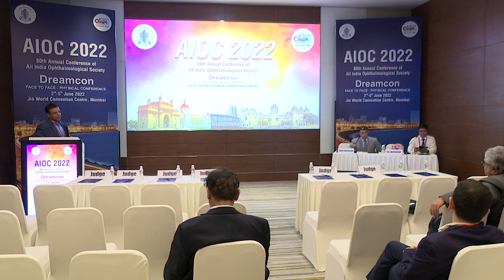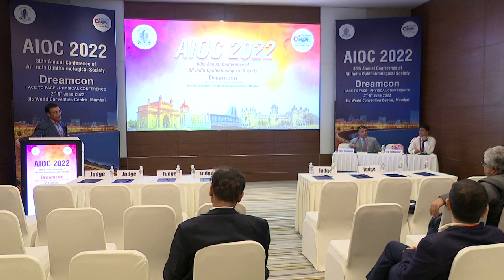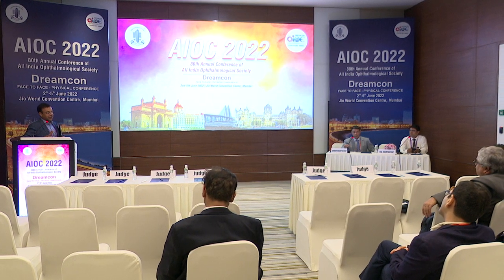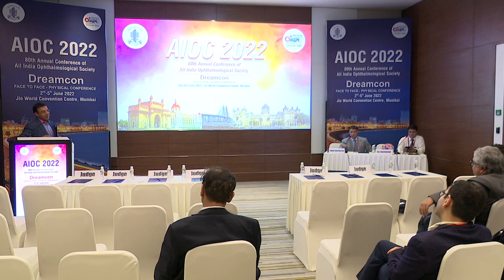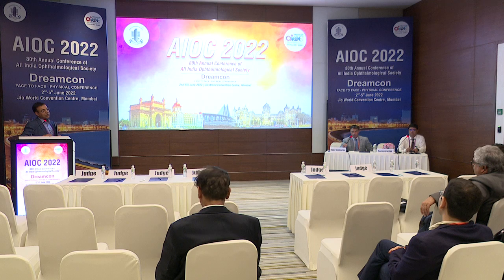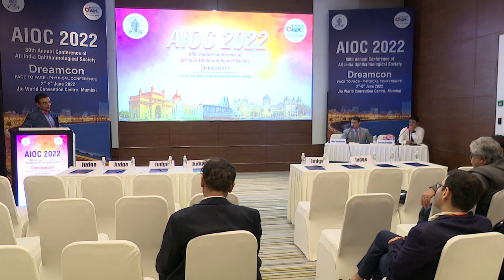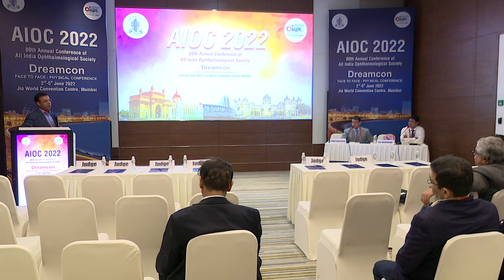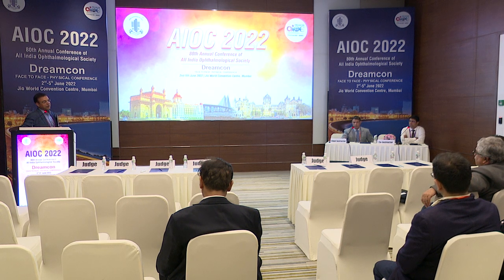I had planned to put in a CTR, but because now my rhexis was broken, a CTR was not going to be possible. So I just decided to go with that, because I had meticulously cleaned the capsule and didn't want to sacrifice it. But yes, if I think about the future, I should have probably put in a 3-piece lens, because I could then later use it to anchor it to the sclera if you need to. The only problem is that by this time, at the end of surgery, after you work so hard and you clean up everything, my thought process was different. But in retrospect, I think I should have put in a 3-piece. That would have been the wiser thing to do, rather than put a single-piece lens, or even take away the bag and do a glued IOL kind of thing.